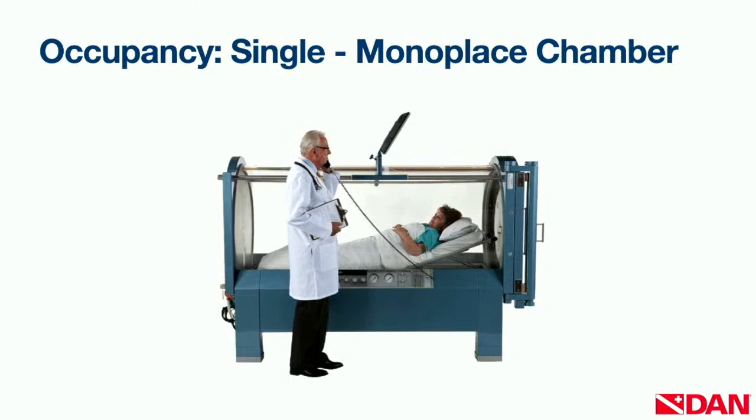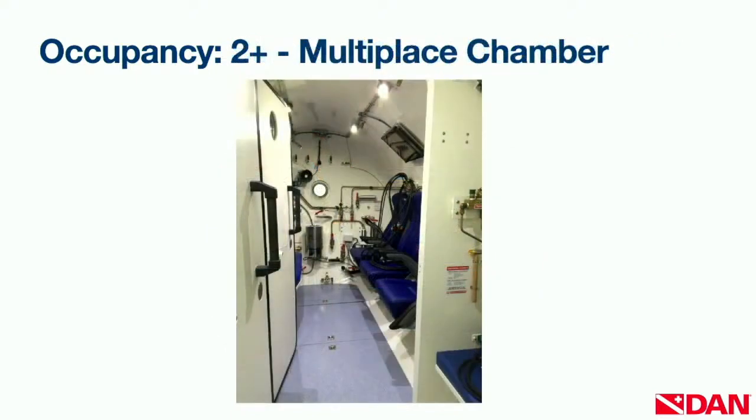Here's a good picture of a typical clinical monoplace chamber. They normally run between 45 minutes and 1.5 hours. That's a typical treatment that they would be used for. But we have very effectively treated really injured scuba divers in these. They're not the chamber of choice, but whatever needs be, when you're stuck somewhere, if there's a monoplace chamber, it's just as effective at treating someone.